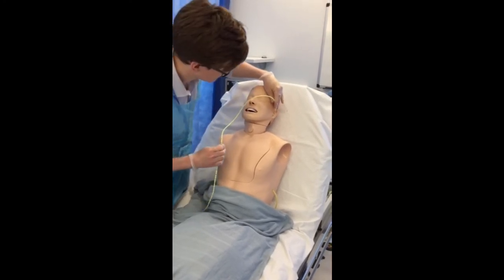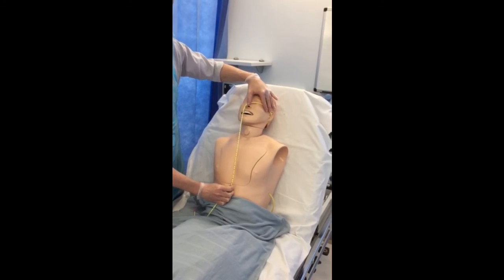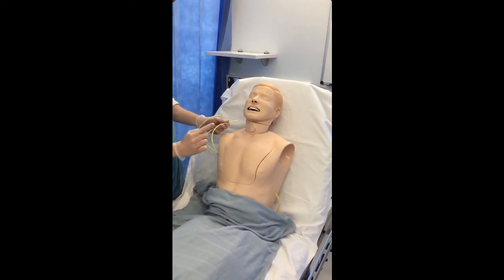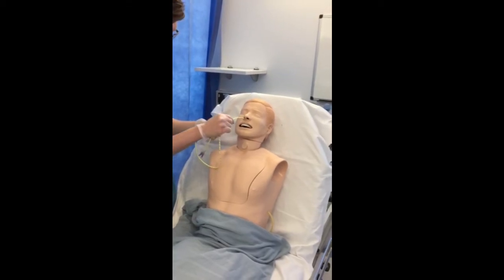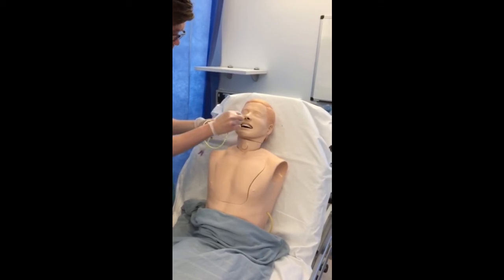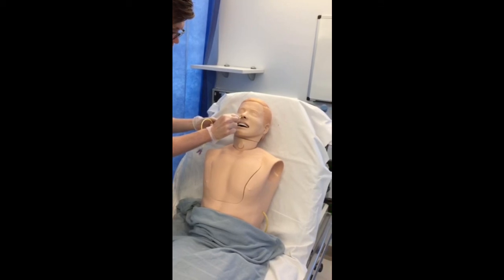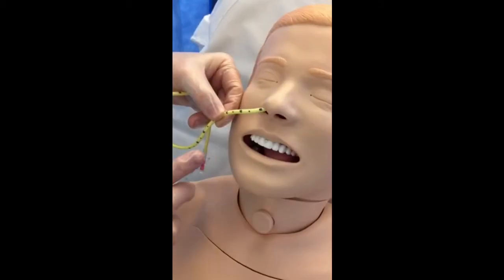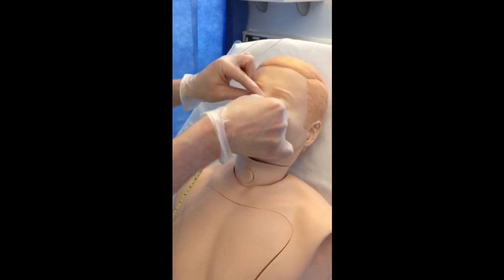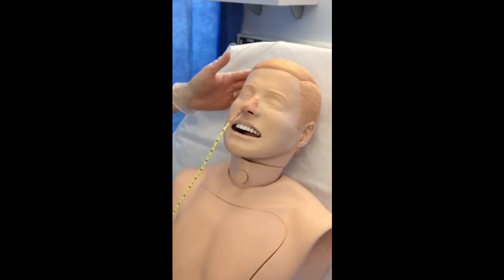Measure the length of the tube from ear to nose to xiphisternum. Here it's 48 centimeters. Ask the patient to blow out of each nostril to see which is most patent. If in doubt, use the right. Insert the NG smoothly, aiming posteriorly and not superiorly. Warn the patient they may feel a gagging sensation, usually at 10 to 13 centimeters. If able, ask the patient to swallow some water. Insert to the pre-measured length, then fix the NG tube using the adhesive dressing. Note the tube type and the distance at the fixed dressing in the notes.